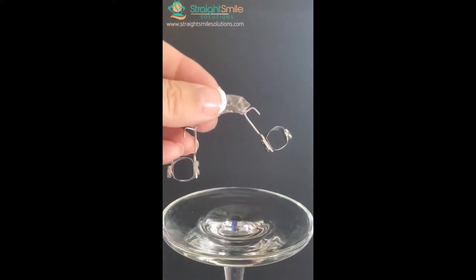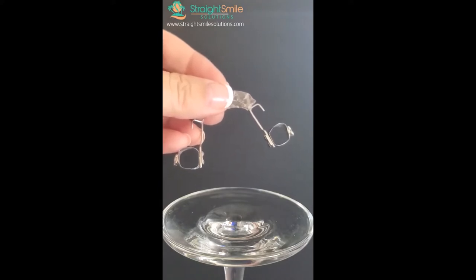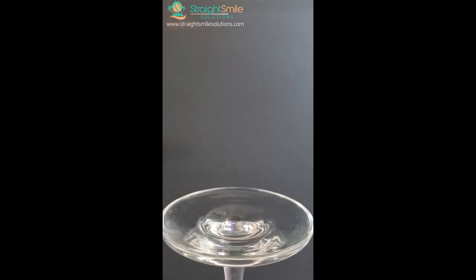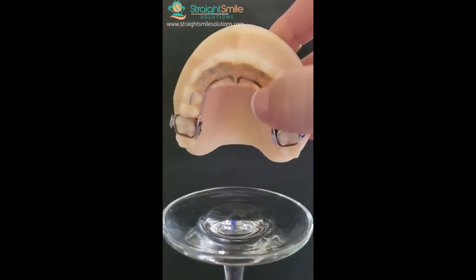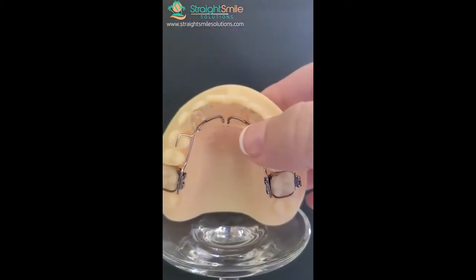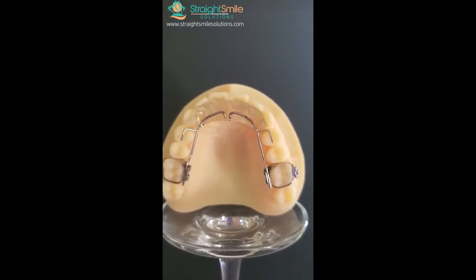When the appliance comes back, put a thin layer of band glue in — my favorite is 3M Unitek Bandlock, which changes from purple/blue to clear on light curing. If the fit is not very tight, use a fuji-based modified glass ionomer, but only if you really need it because it's harder to remove. Try it in first to make sure it fits, then cement it and light cure. This should stay in a minimum of four months, ideally longer.